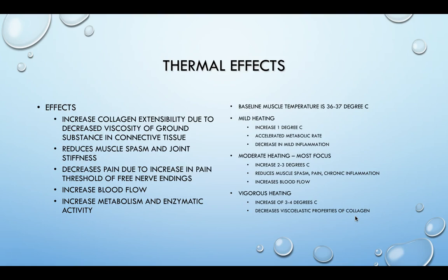So for about 5 minutes from the end of the heating, end of the treatment, okay, those tissues will remain malleable. And so we would want to actually be using that to do stretching, to do joint mobilizations or traction that we're going to learn later in the semester, and use that heat to help stretch out those tissues so that they return to normal length.